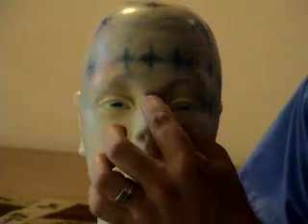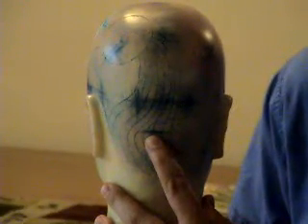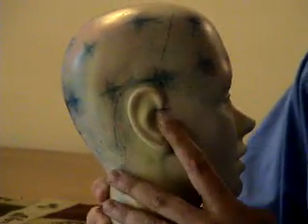There are only 4 points that you need to know or find on the patient in order to mark a head. It is the nasion, which is right there, basically the bridge of the nose. The inion, which is right there, which is basically at the end of the skull. It's a little bump just at the end of the skull. You run your finger down the back of the head until you feel that. It's also the preauricular creases, which are right here. Obviously they're located on both sides of the head because they're just at the end of the curvature of the ear.